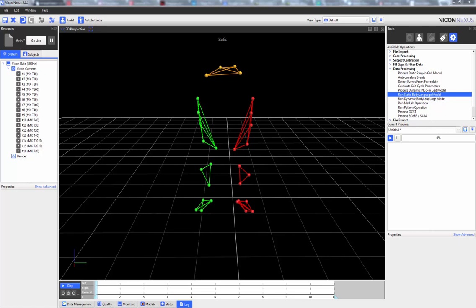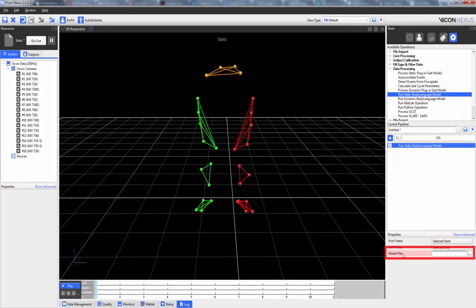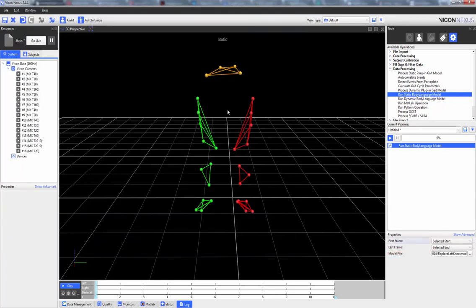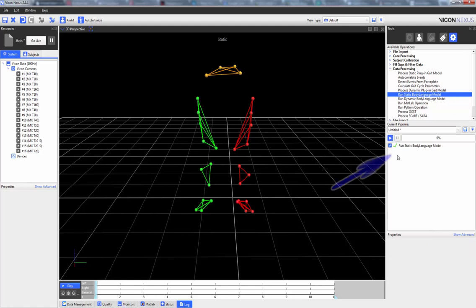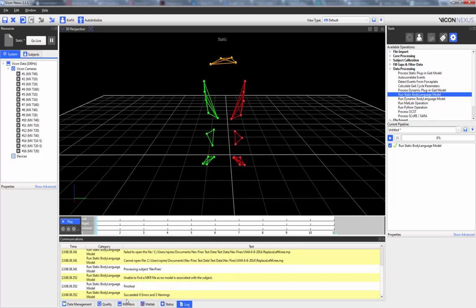Now that we've seen the code, let's see it in action. I've already loaded a static trial with all the appropriate markers — the three on the left thigh cluster and the two left knee markers. I'm going to load the Run Static Body Language Model pipeline operation. When I click on it, I need to load the model file by pressing this button. I've navigated to the folder containing my model and double-click it to load it. When I press play, we can see with the check mark that the model has been run successfully, and opening the log confirms the code succeeded with zero errors.